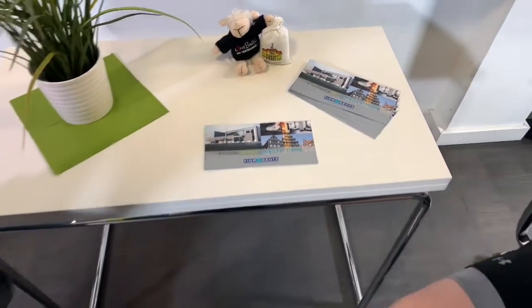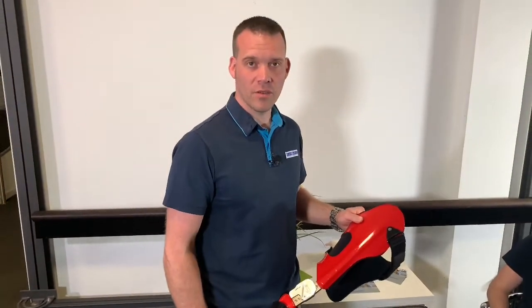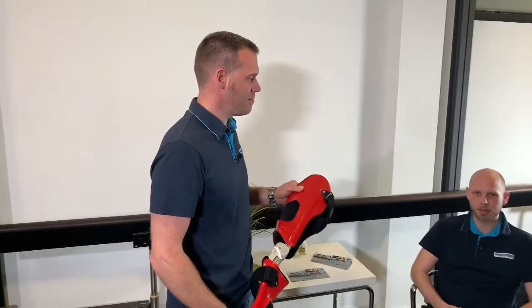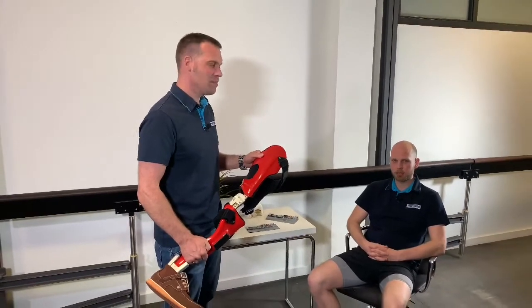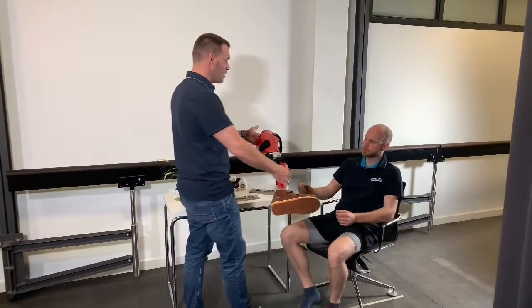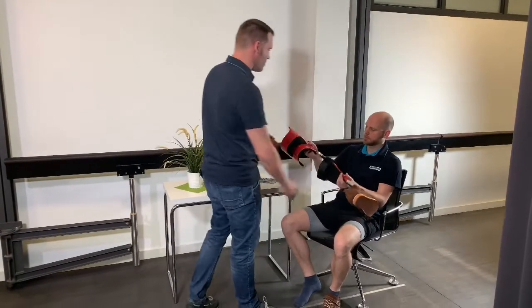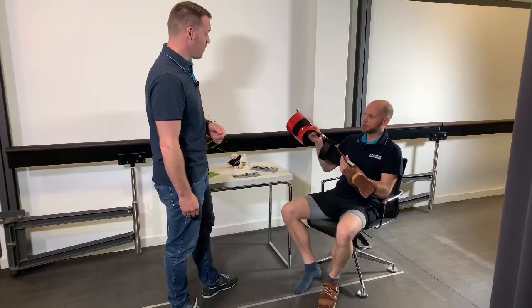Before we continue with the functional check of the static alignment on the patient, we should familiarize the user with the new orthosis. My name is David, and I will test the simulation orthosis for you today. Look David, this orthosis was custom-made for you. It's quite light, but it still seems to be very stable.